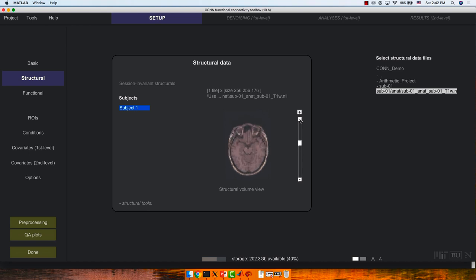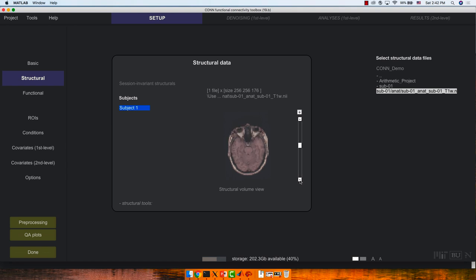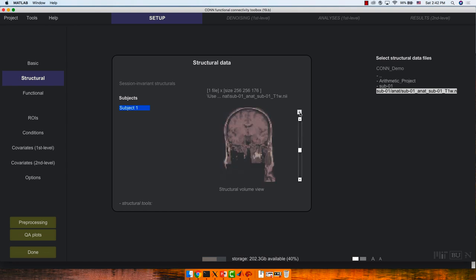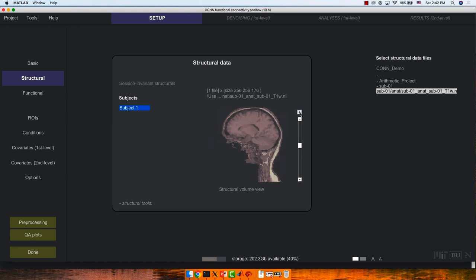Artifacts are rare, especially in healthy subjects, but you do find them. This plus sign up here will switch the view between sagittal, coronal, and axial. You'll notice the subject is missing a face — all data uploaded to OpenNeuro has been de-identified. The face has been removed, and if you want to upload your data, you'll need to deface it as well.